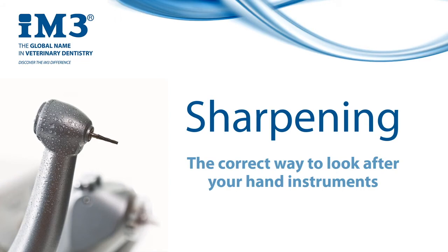Hello everyone, my name is John and today I'm going to talk about sharpening. Sharpening is essential maintenance for your dental hand instruments and no dental kit is complete without a sharpening stone for that reason. It does require technique but this is very easy to learn and it only requires minor tweaks depending on the instrument you are working with. As always, if you have any questions please don't hesitate to contact us or your local IM3 representative.